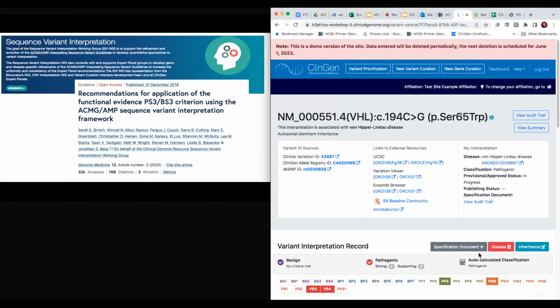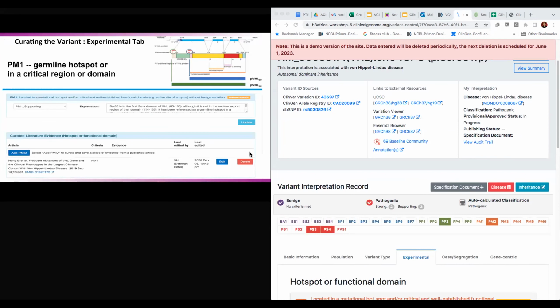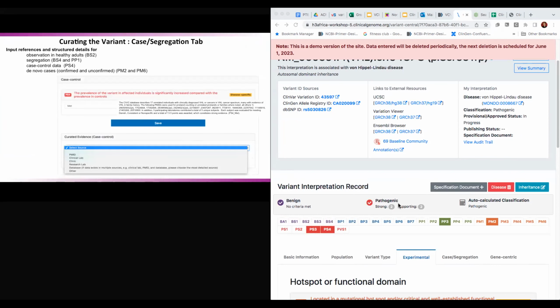And we do recommend if you ever reference a PMID in a comment that you do add the paper down below. I know Deb for time is doing it backwards and doing the code first. Typically you add the paper in the PMID, then you say that paper meets the code, because then the VCI saves all the papers that are added. And it makes a list at the end of every PubMed ID you've used.